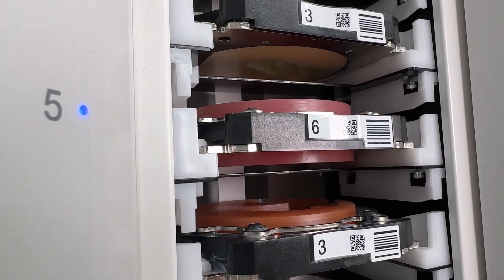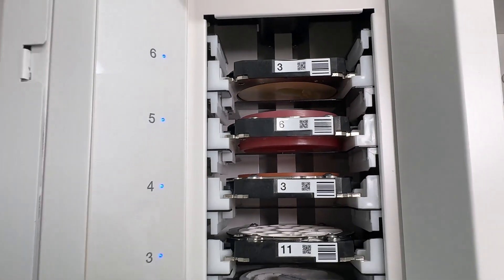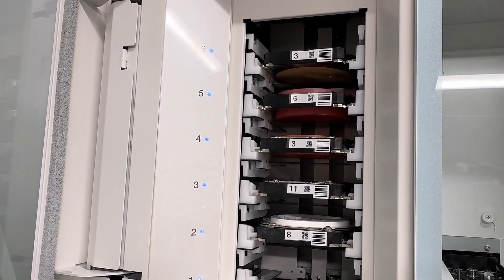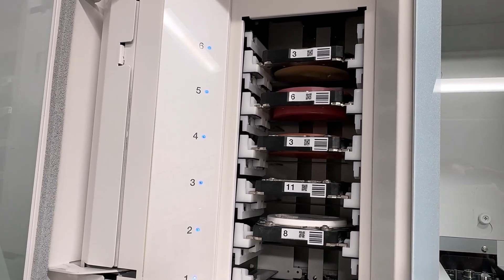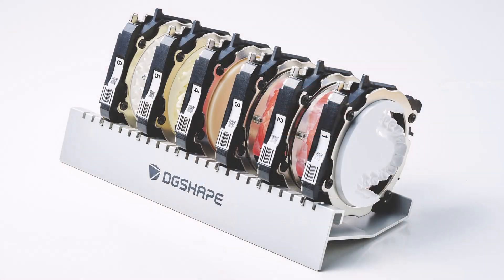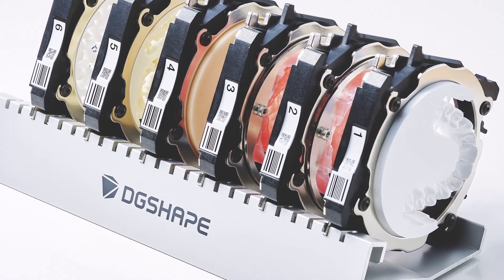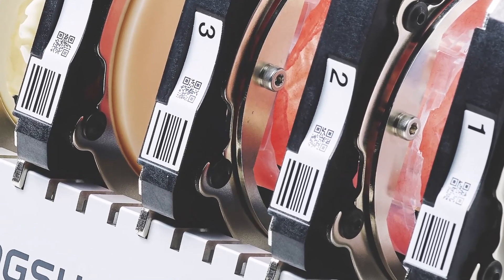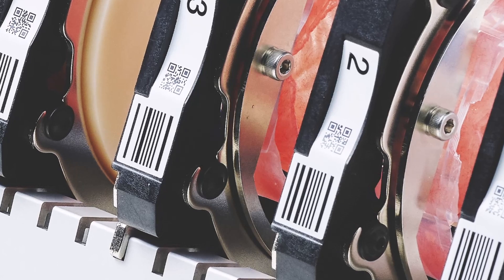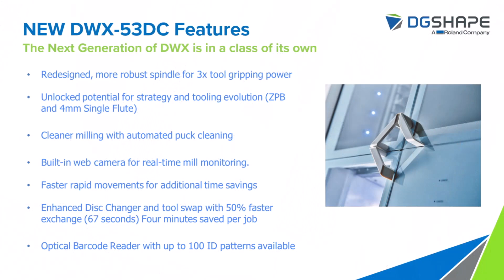We've reduced the puck change time in the 53DC by 50%. In the older model, the 52DCI, those changes took roughly two minutes and seven seconds. We now have that down to just about one minute, making the machine more efficient and saving time overall. We also heard customer demand for more ID patterns — we moved from an alphabetical A-through-Z system to a numerical system opening up one through a hundred, so you can have a whole library of puck holders to transition in and out of your machine with a puck changer.